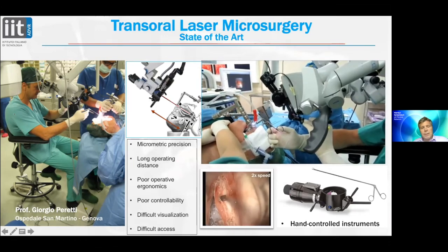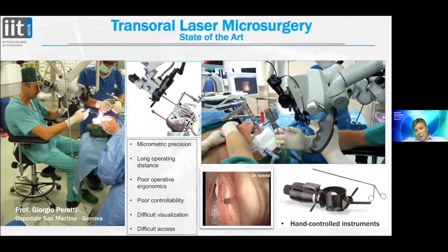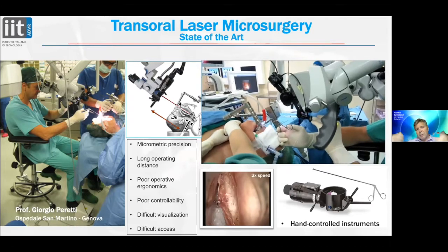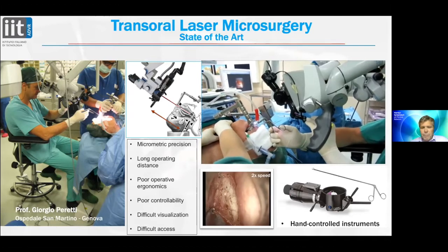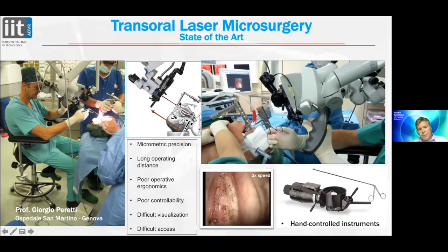The surgeon is sitting a little bit hunched over to be able to see the microscope with the arms up and raised. They have them on a chair, but still they're up and raised. And he will be doing this for long periods of time. So it's a lot of pain in the back, a lot of pain in the neck, a lot of pain in the arm. So it's poor ergonomics combined with controlling of a foot pedal, which we see down here. So there's a hand-eye-foot coordination.